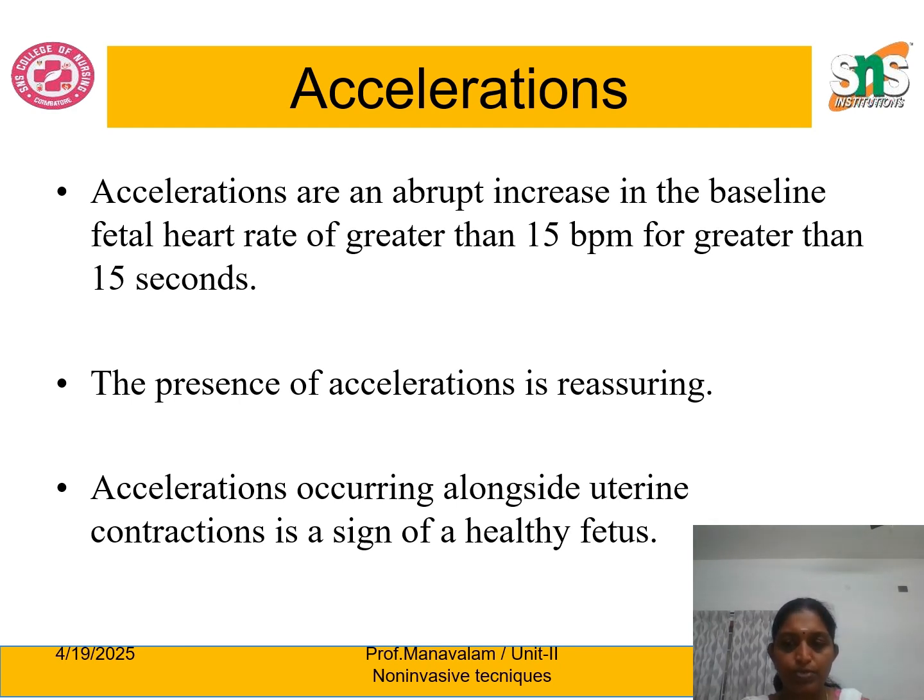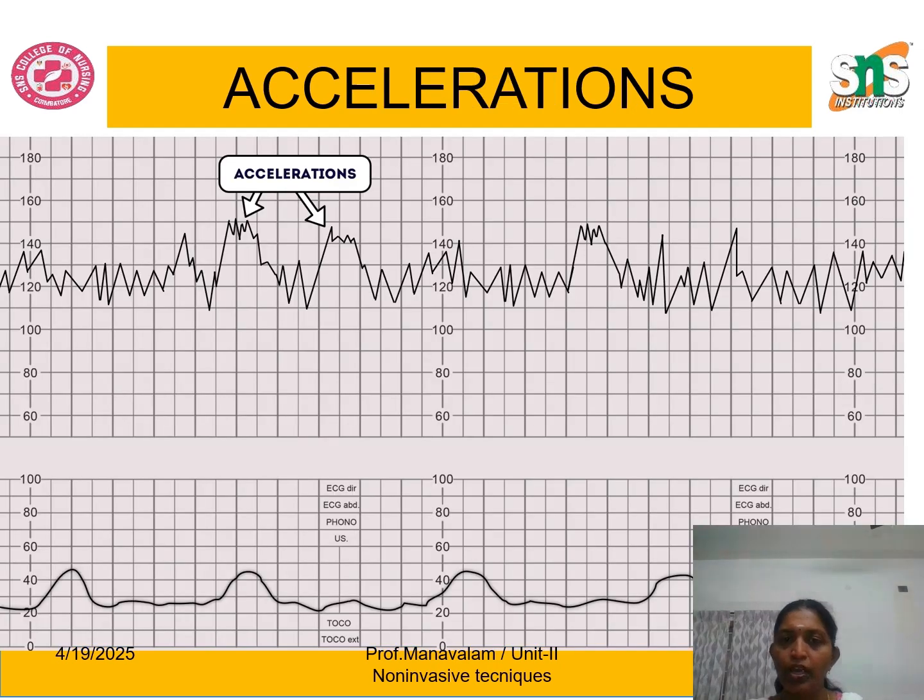If acceleration is present in the cardiotocography, it indicates that the fetus is reassuring. There is no complication to the fetus. The fetus is healthy. If the acceleration occurs along with uterine contraction, then it indicates that the fetus is very healthy. No need to worry about the fetus inside the uterus. Always, the acceleration as well as deceleration occur along with the uterine contraction that is experienced by the mother during the time of labor.